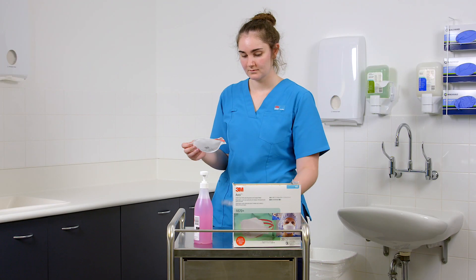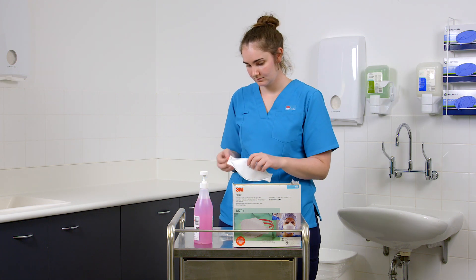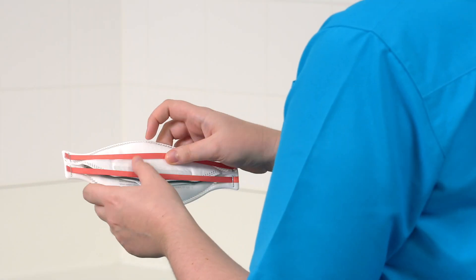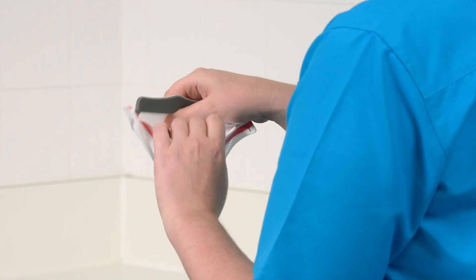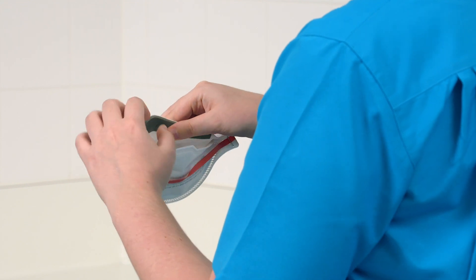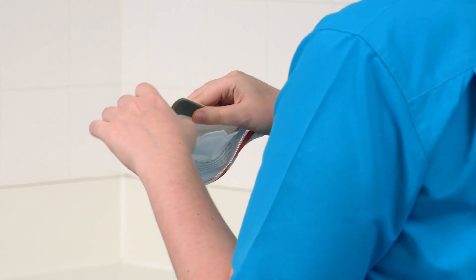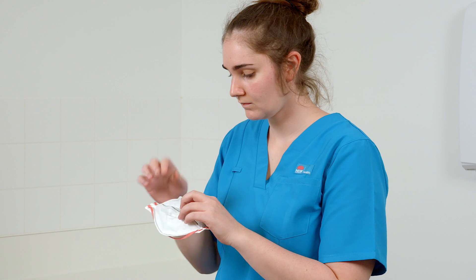Remove the respirator from its packaging and inspect all respirator components for damage prior to each use. With reverse side up and using the tab, hold with the straps facing upwards. Fully open the top and bottom panels, bending the nose piece around your thumb at the centre of the foam. Make certain the bottom panel is unfolded and completely opened.